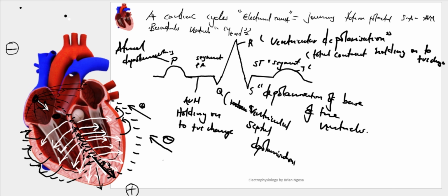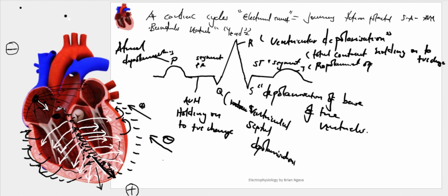So the T wave, what does it represent? The repolarization of the heart. So this we are not taking in specific segments, just repolarizing the heart completely. And how is it spreading? From the base up to the atrium level. And that's why we are having this upward deflection.